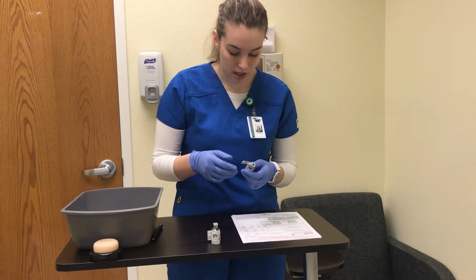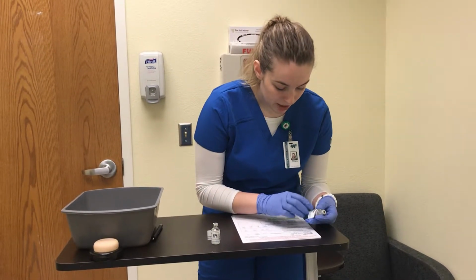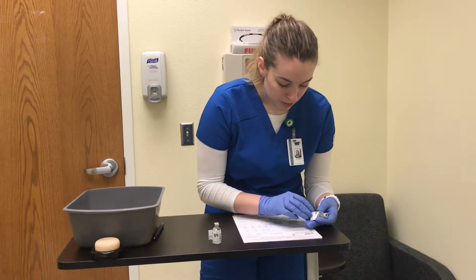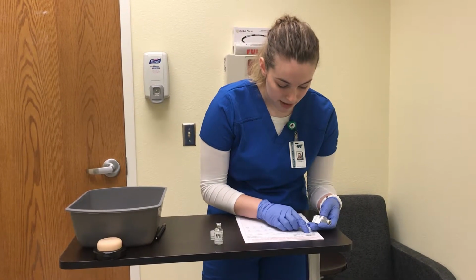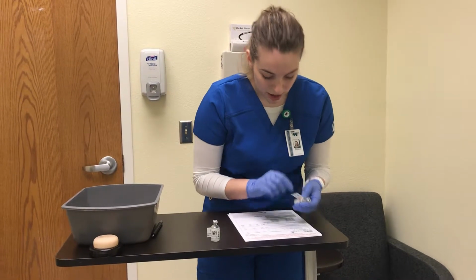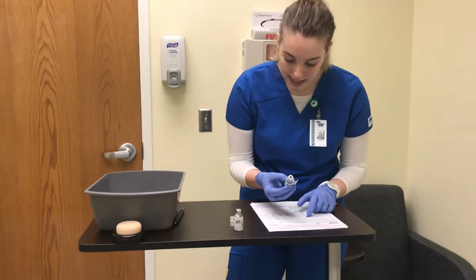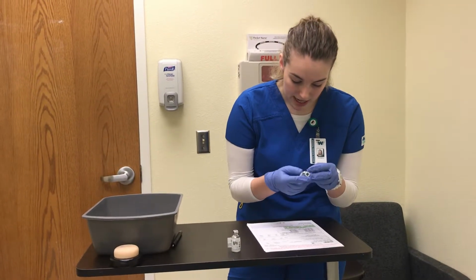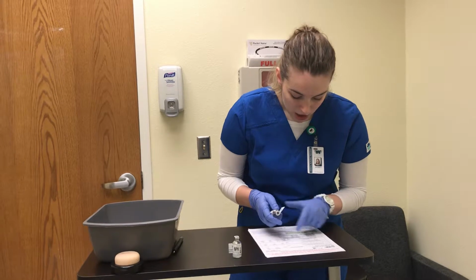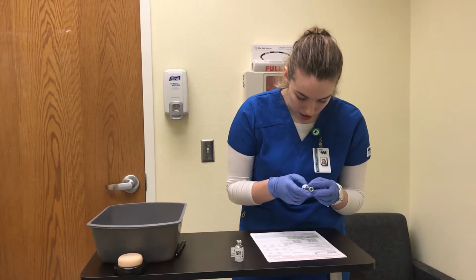Okay, next I have my regular. So first I have Shirley Coast, 54, female. Date of birth, 5/14/64. Dr. Leo, room 211-1. So I have my regular insulin, and it is a U100.